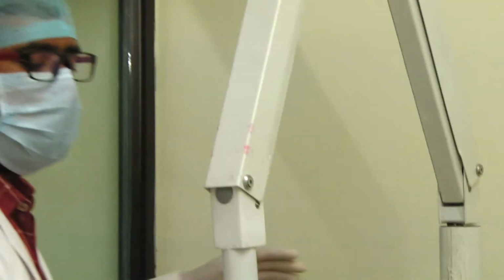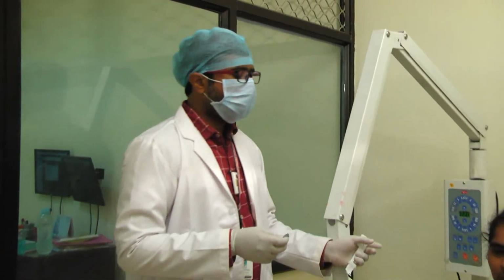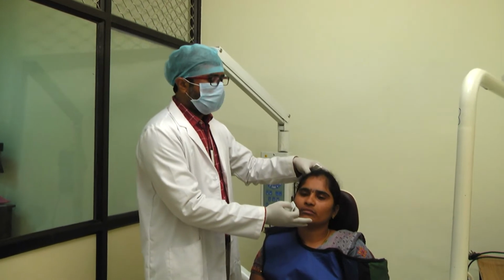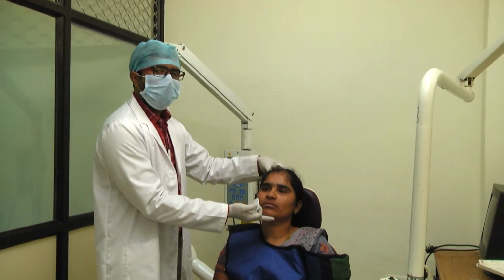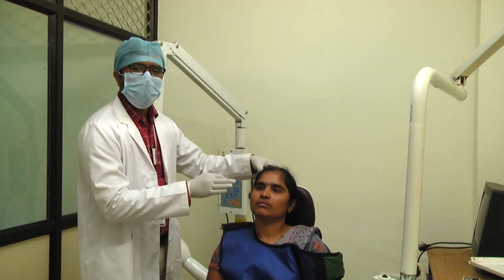And now coming to the projections for the mandibular teeth. Always for radiographs of the mandibular teeth, slightly raise the head or tilt it back, in order to compensate for the changed occlusal plane when the patient is wide open.